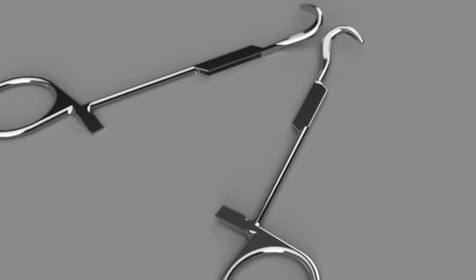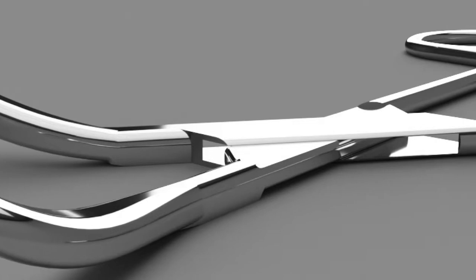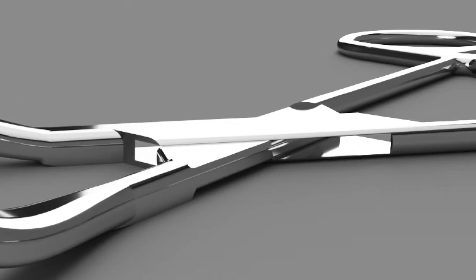The towel clamp consists of two separate pieces that are joined together with a pin connection. This allows the surgeon to open and close the tip of the forceps with one hand using two small ring handles.